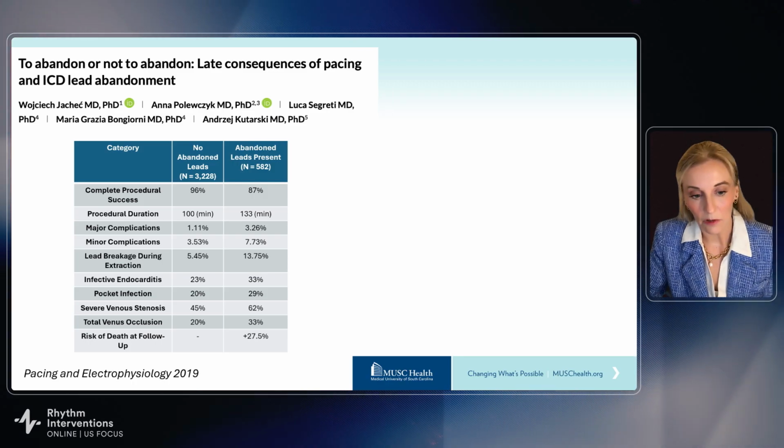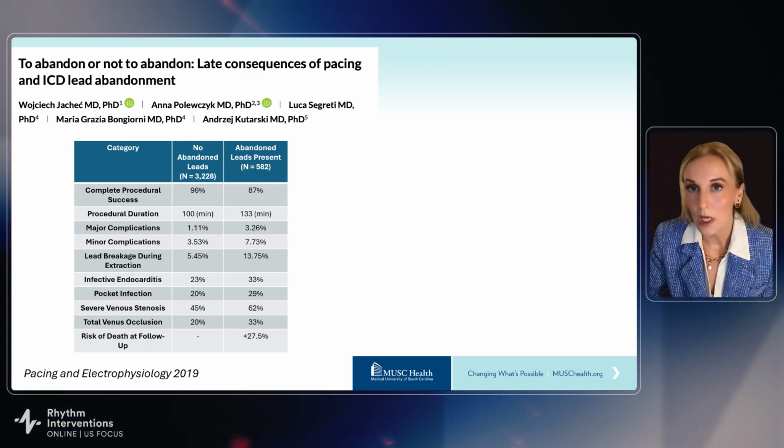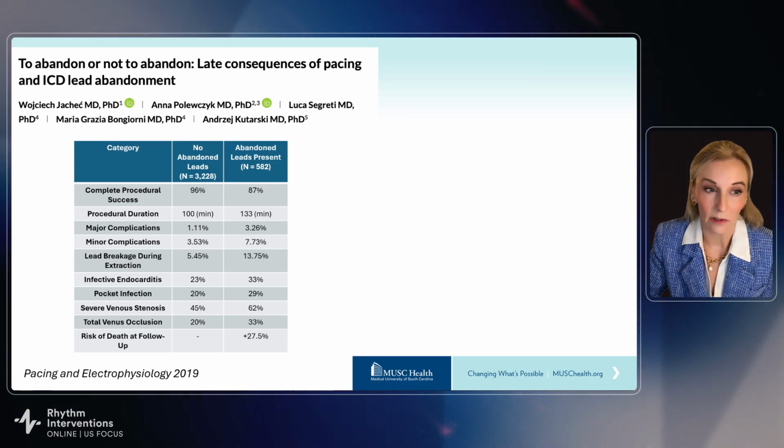Instead of just removing a few leads, we're having to clean up a large mess of leads that have been left behind previously. Because a lot of these abandoned leads are older, they may have problems. So again, the complete procedural success of an extraction procedure goes down when there are abandoned leads present.